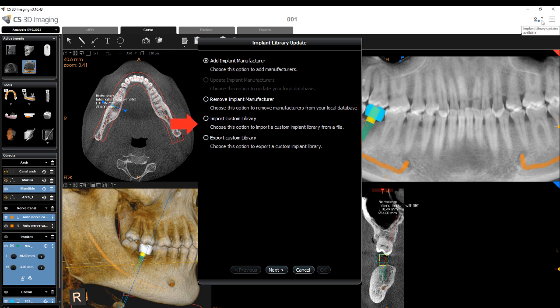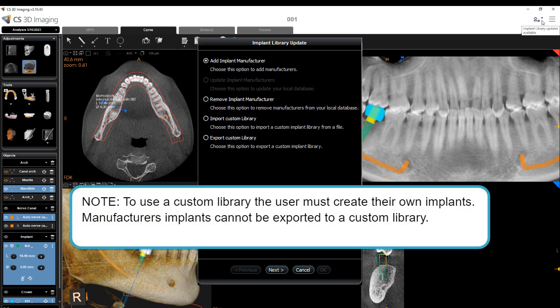Additional options include export or import a custom implant library. Note: to use a custom library, the user must create their own implants. Manufacturer's implants cannot be exported to a custom library.